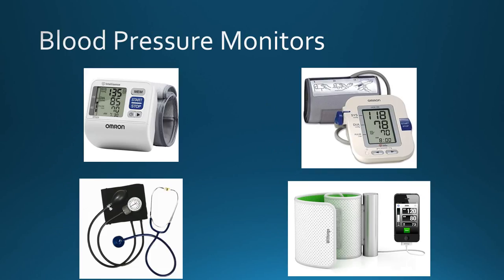So the first test that we'll discuss are actually monitoring devices, and it's blood pressure monitors. And this is what I've encountered the most within my practice as a patient who wants a recommendation for a blood pressure monitor. And as you can see here, there's several different styles. The one on the top left is a digital wrist monitor, and then a digital arm monitor to its right.